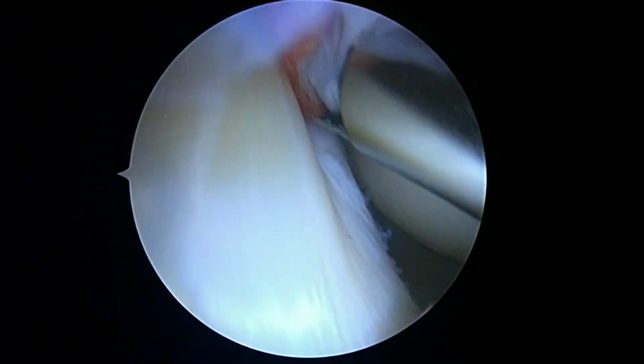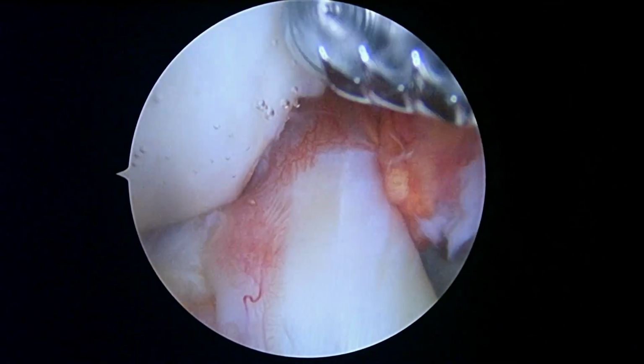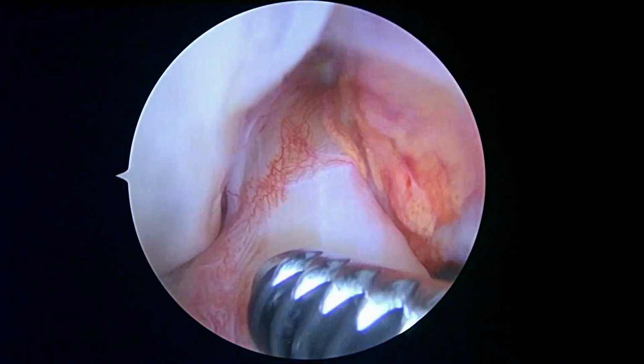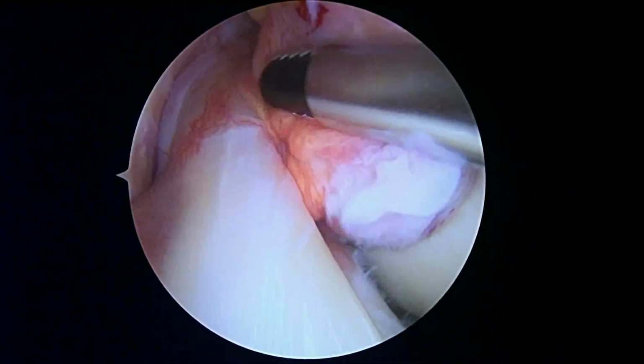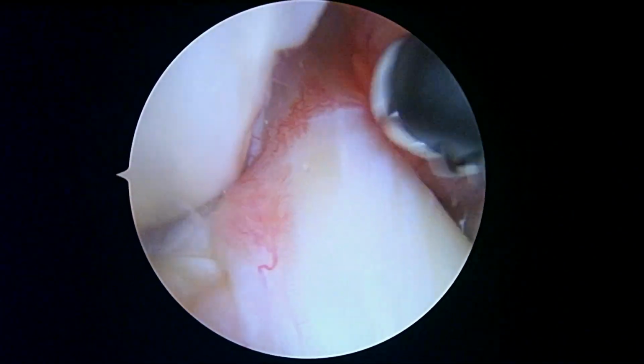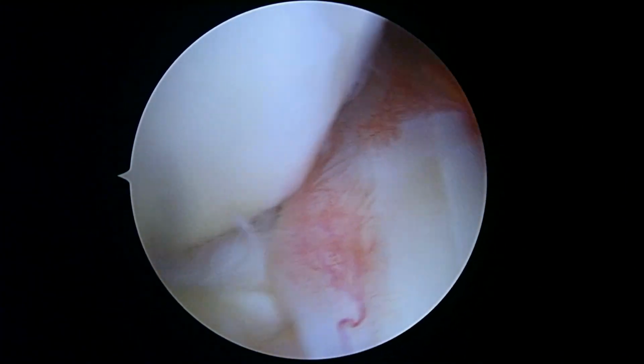Okay, so this is your anterior cruciate ligament here, and it looks pretty good. That couldn't look better. The posterior cruciate ligament's just to the right behind this little fat pad, but the ACL looks good. We're going to look in the lateral compartment next.